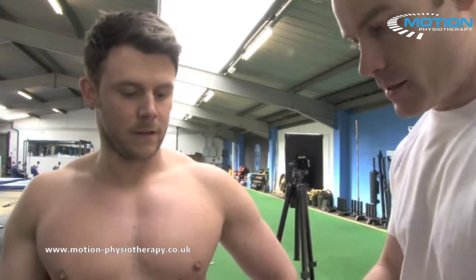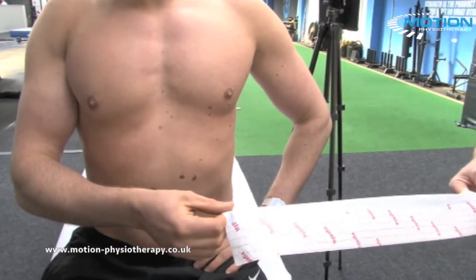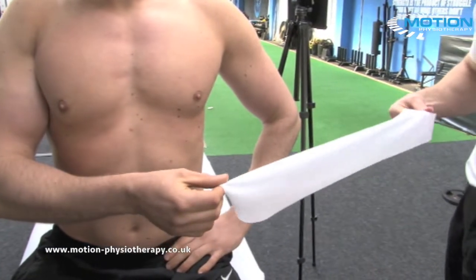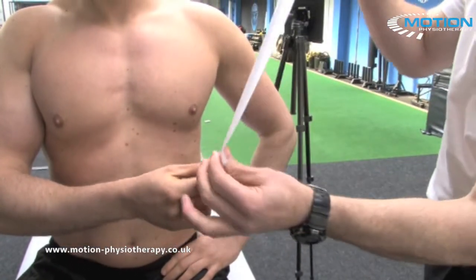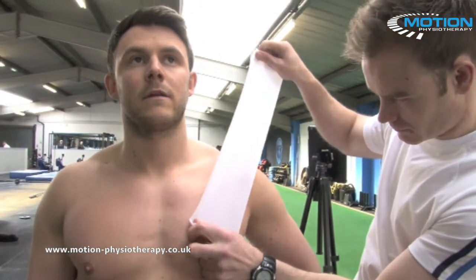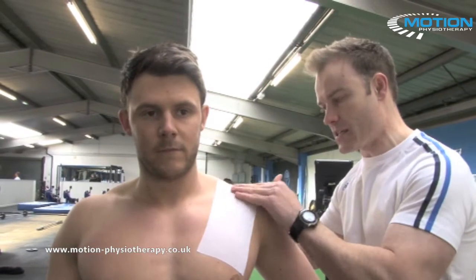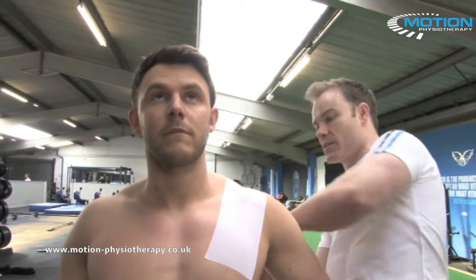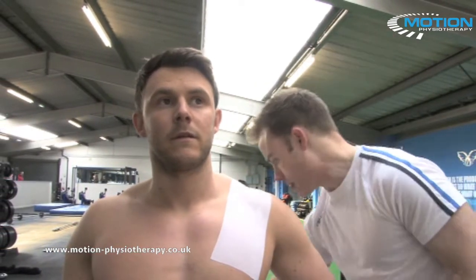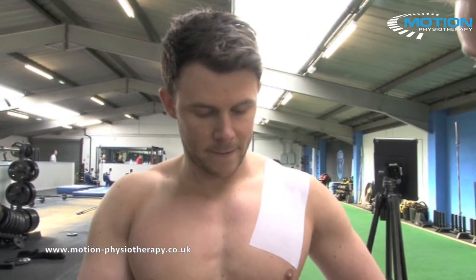We're going to lay down some Hyperfix anchors, which allows the patient to take over the end of the Hyperfix. Laying this down to give a good bonding surface, staying away from the nipple and coming over so the middle of the Hyperfix is going over the AC joint and coming down to the mid-scapular at the back. Another couple of smaller strips are added where the anchors are going to end up from the technique.